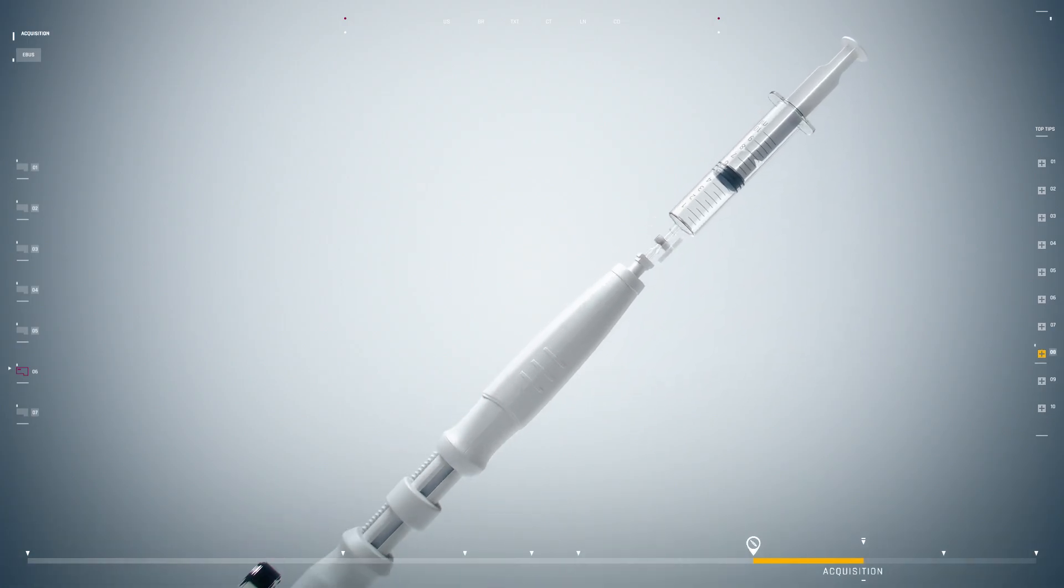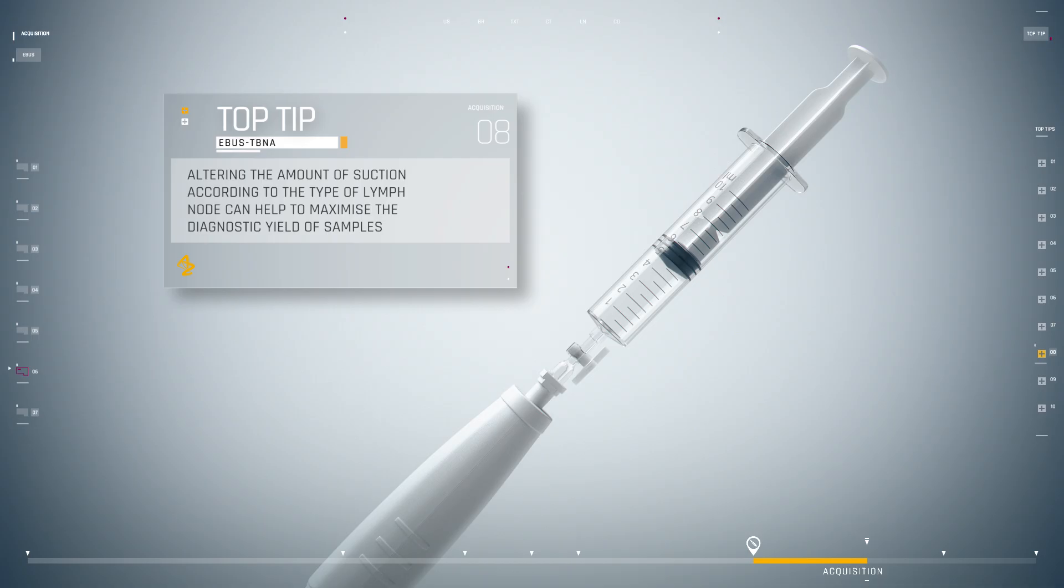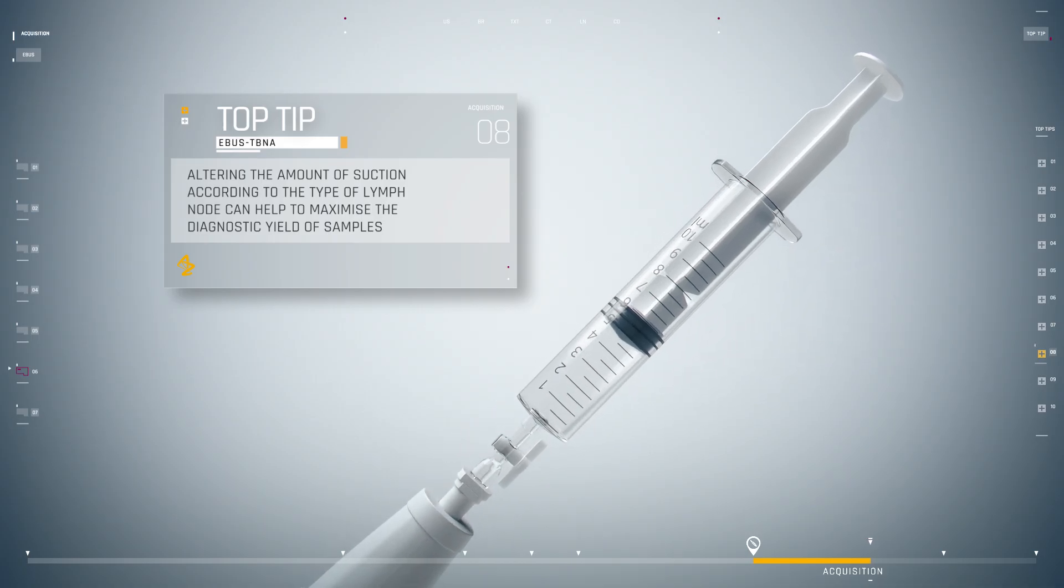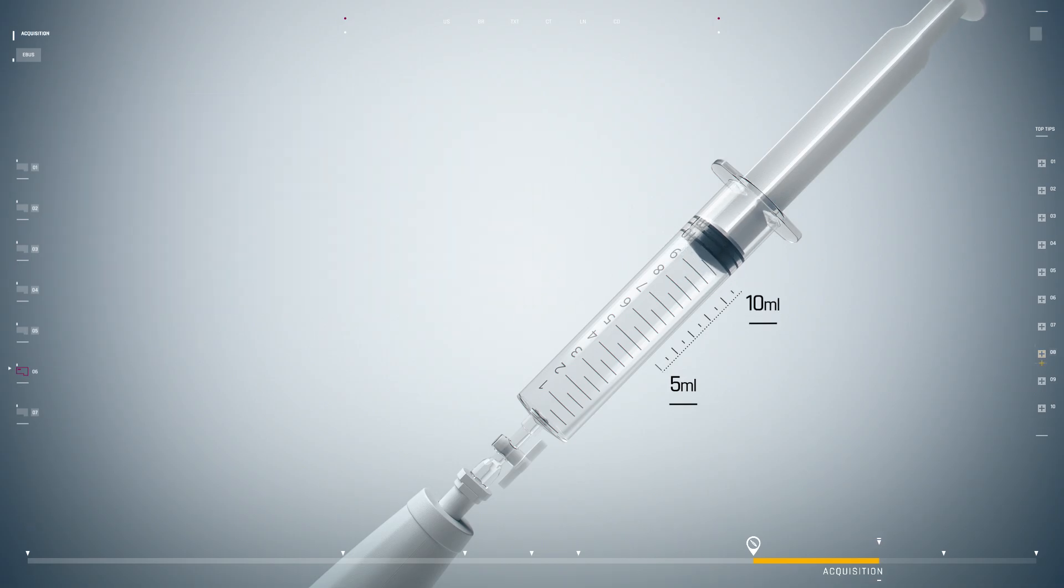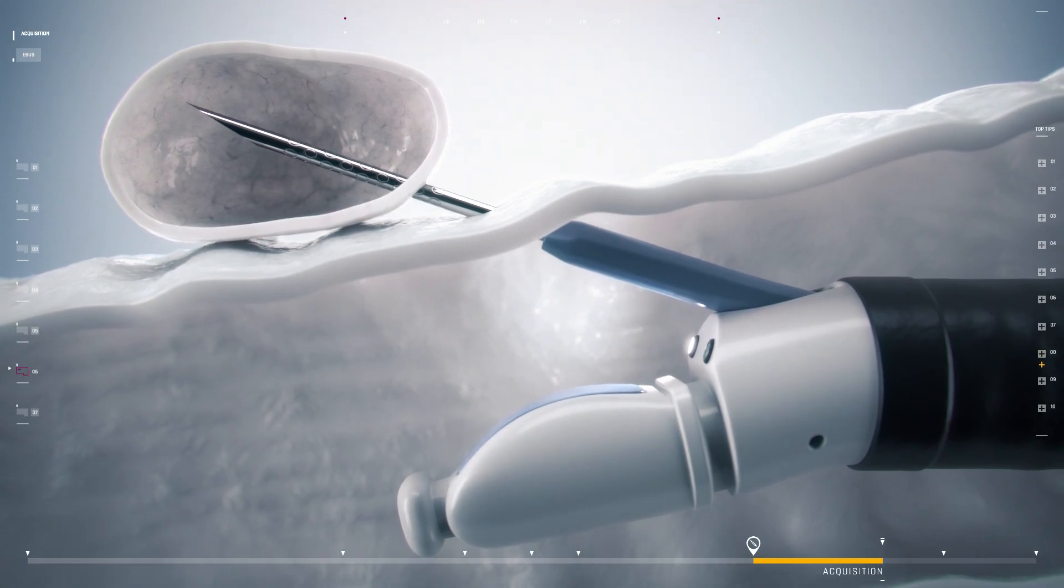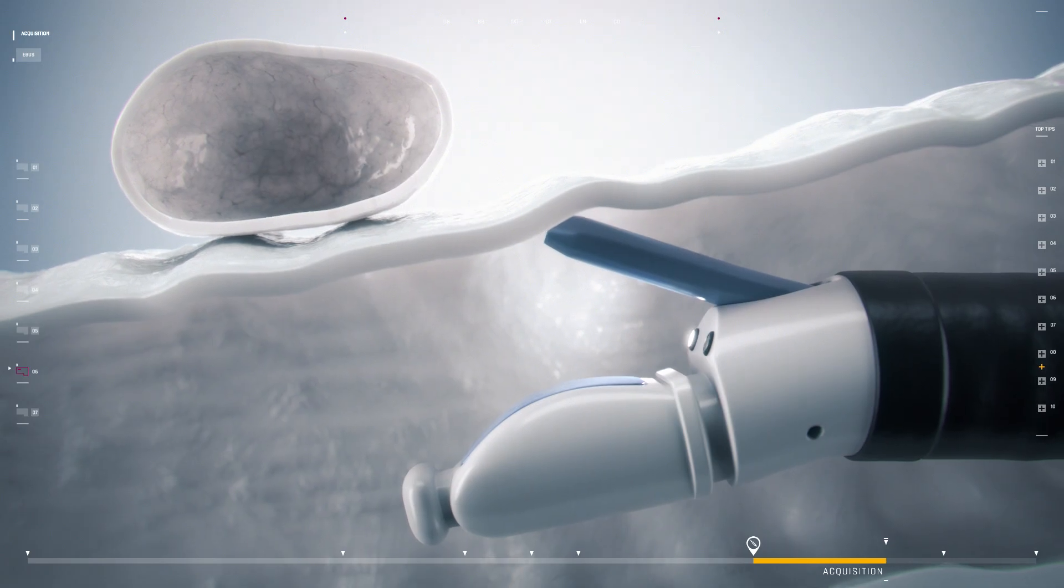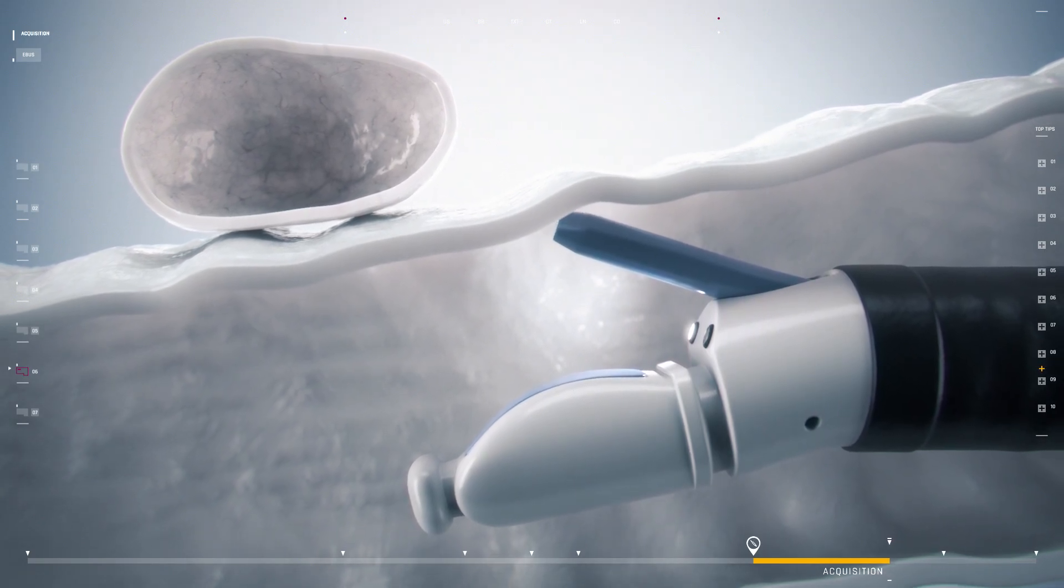The amount of suction should be altered according to the type of lymph node. For example, hard lymph nodes may provide limited samples, and increasing the amount of suction can help to improve diagnostic yield. Suction should be stopped before the needle is retracted into the sheath and locked, then the needle and sheath are removed.